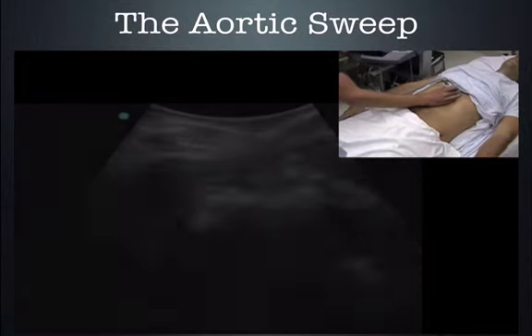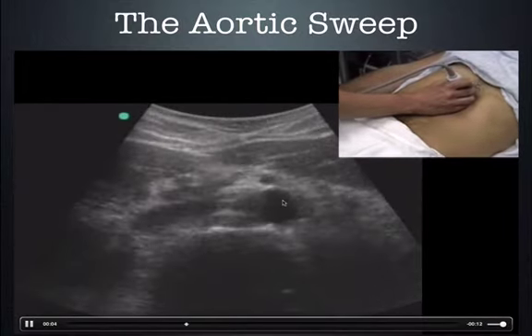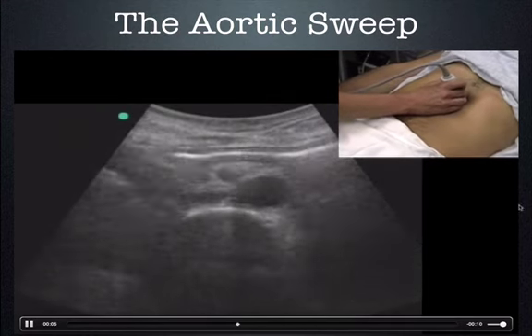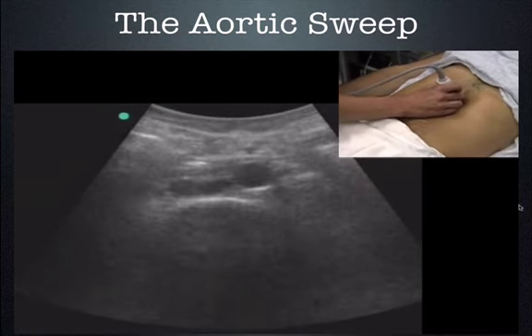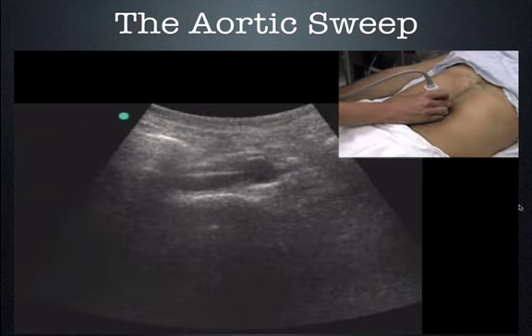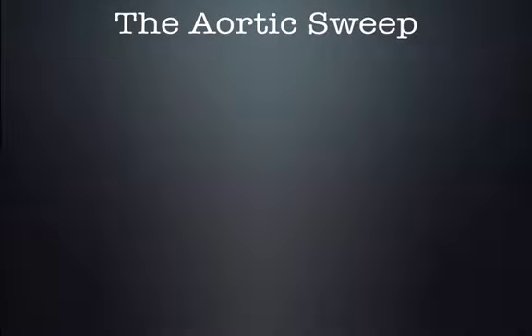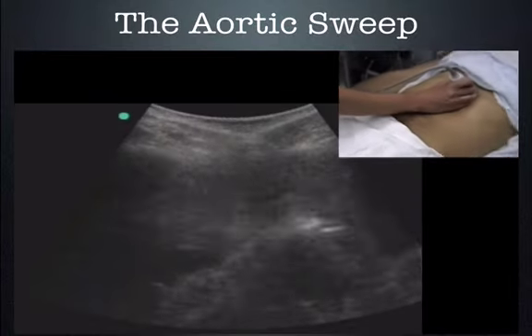Let's have a look one more time. Here's the spine with shadow. This must be the aorta. We're running down, making sure there's no obvious abnormal dilations. And we'll restart this one more time just to see as they place the probe in the superior portion of the abdomen. You can see initially the aorta is quite difficult to identify.